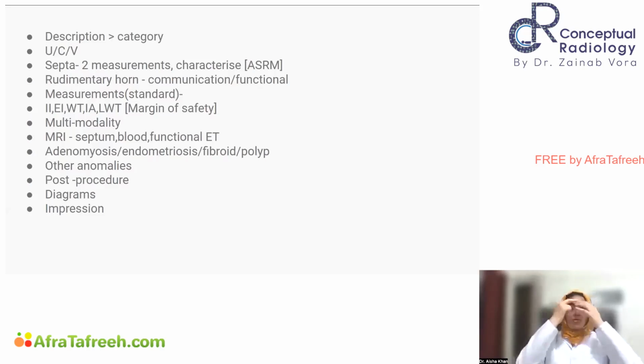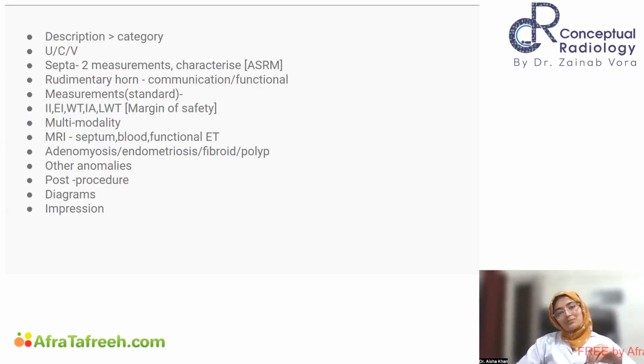Post procedure also, a lot of times they will do septal resection and they send the patient again to see post procedure what is the status of the cavity. Diagrams if you make, it is very much going to complement your report. And then finally impression में, if you are able to put it into one category, you say that okay, according to ESHRE/ESGE criteria 2018, this is classified as septate uterus with septate vagina or whatever. If you're not able to put a particular final impression, no problem. You keep your report descriptive and don't force fit ever.